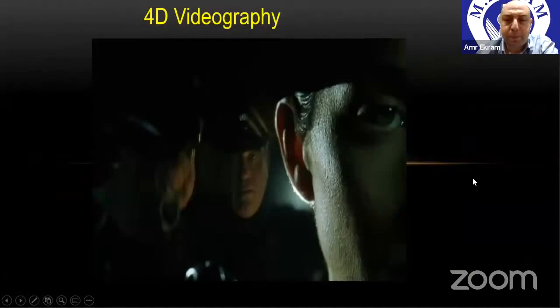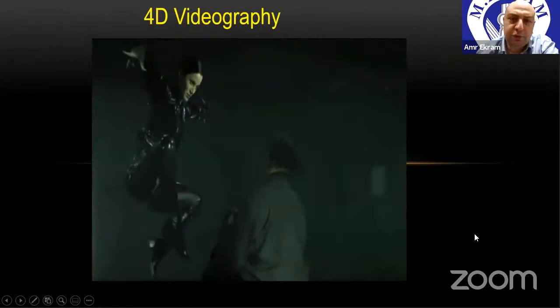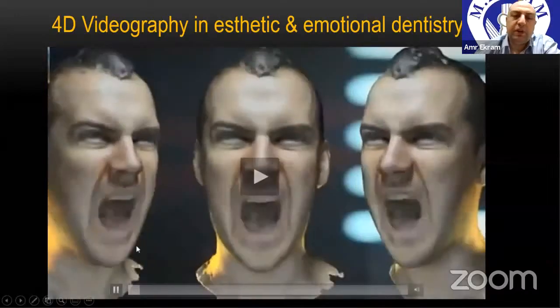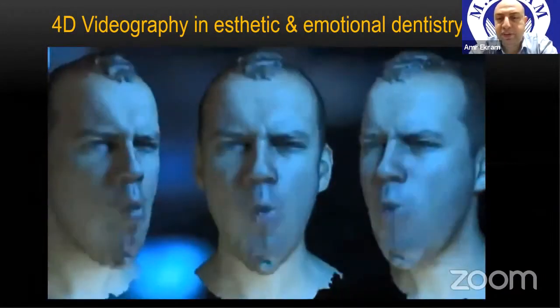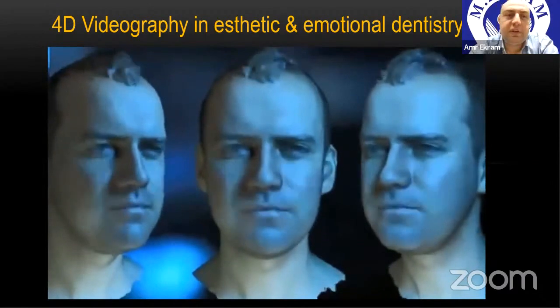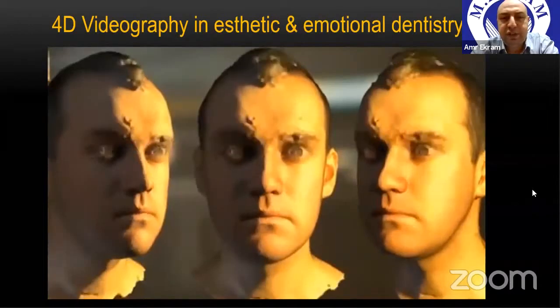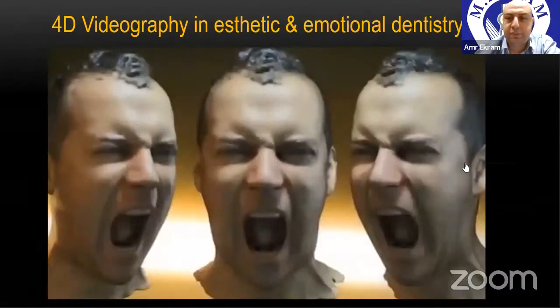4D videography. You see this video. How was this video performed or shot? It involves taking the same shot using different cameras from different angles. And this is useful for emotional dentistry and analyzing your smile from different aspects and facial expressions. So 4D videography is superior, of course, to regular videos. It gives you the same video from different angles. And it's already available nowadays, like 3dMD and other companies, they manufacture those 4D cameras.